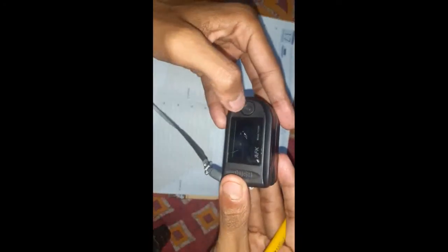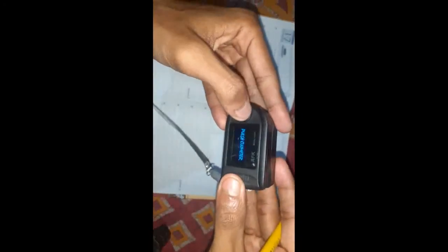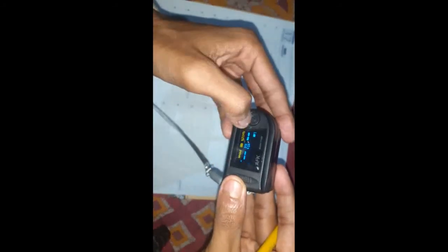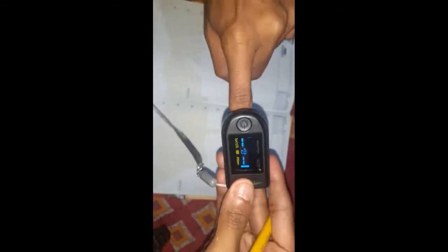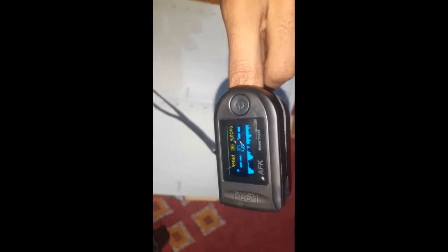How can we use the pulse oximeter? First of all, there is a switch. If you click the switch, you can see this is the pulse oximeter. If I put my finger, any finger you can put, you have to wait for 30 to 40 seconds.